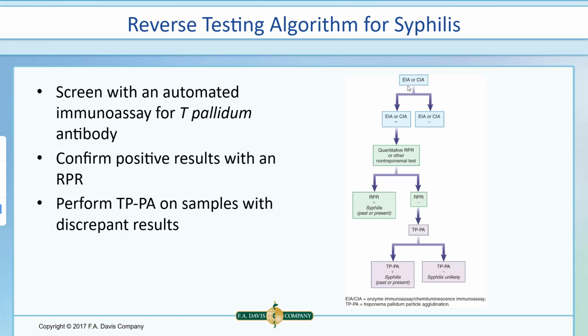Special diagnostic areas. There is molecular testing available, patient monitoring. Congenital syphilis, perform non-treponemal tests on the mother and infant at birth, and then IgM-specific treponemal assays to confirm. And then neurosyphilis, you're going to perform the VDRL or ELISA on cerebrospinal fluid.